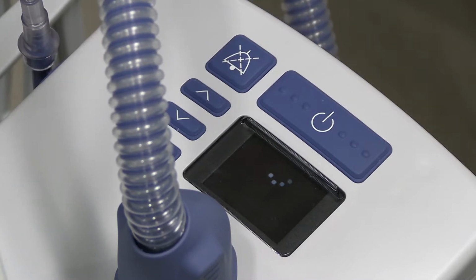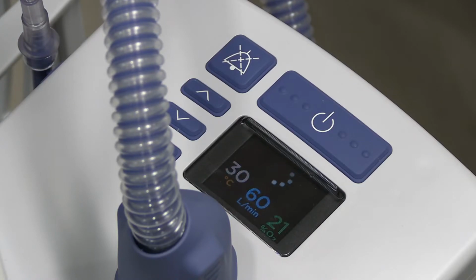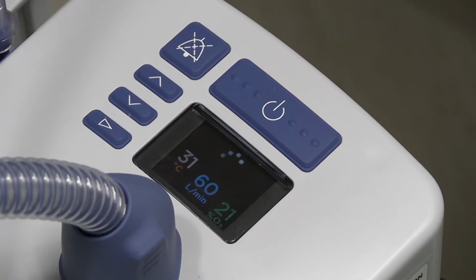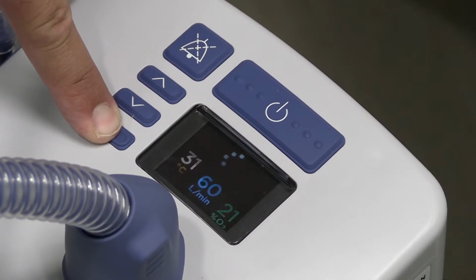One thing to keep in mind is the device does default to the last mode, whether it's adult or junior mode, that it was last used in. And as you can see right now, it's actually at 60 liters per minute with 21% oxygen, and the temperature is set at 30 degrees. So knowing this device as I do, I know this is currently in adult mode. So in order to switch it into junior mode, we want to come to the mode button, which looks like the play button on the device, and just hold that down for 5 seconds.